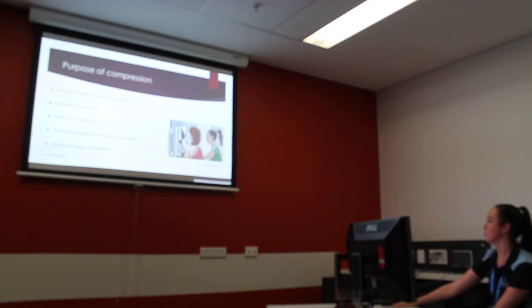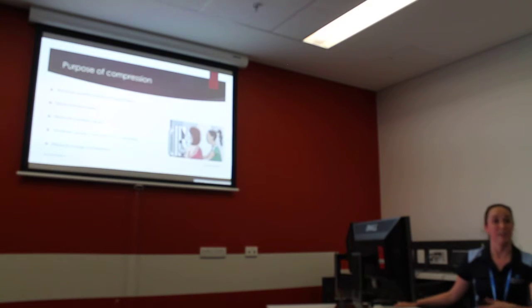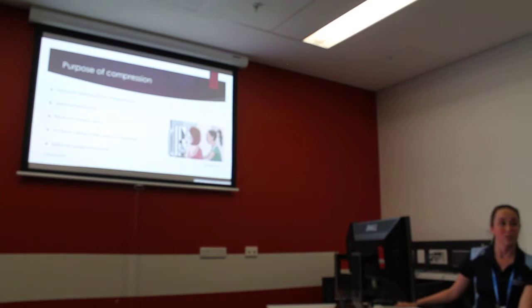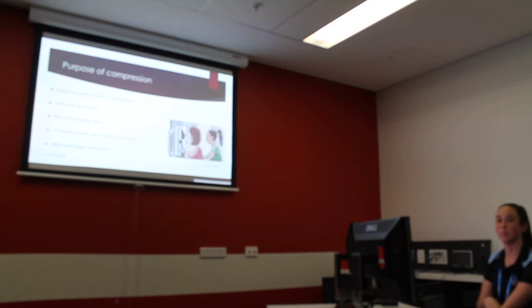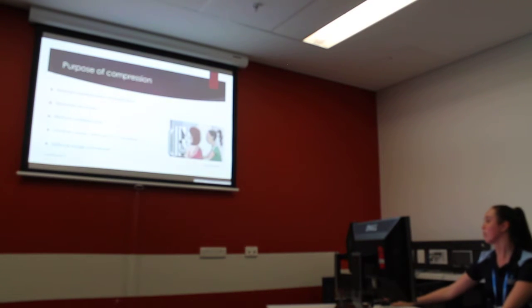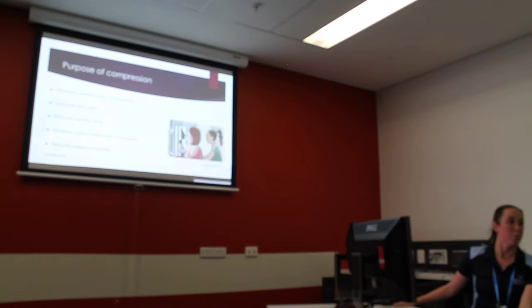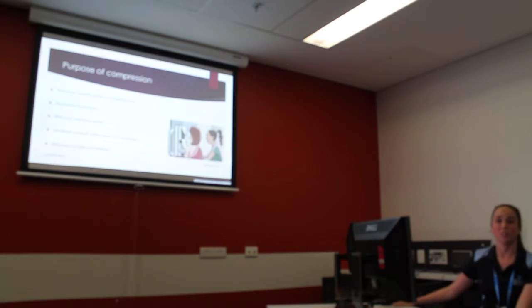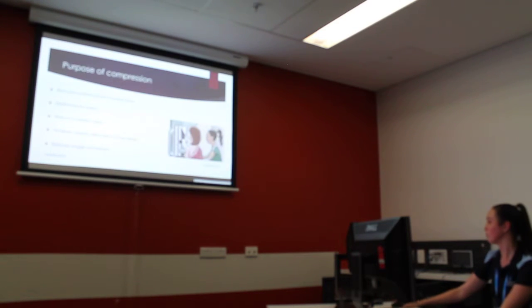Alright. Okay, so compression is also a very important aspect to the mammogram. However, the patient can only withstand so much, and pain thresholds differ between their age, their menstrual cycle. There may be some pathology as well, so they might have an abscess. If they've got discharge when you're compressing, that may be a little bit uncomfortable as well. So this is what they fear the most upon approaching their mammogram, okay? And this short period of discomfort obviously has the ability to save their life and provide a diagnostic image for the radiologist. So we use compression for the following reasons.